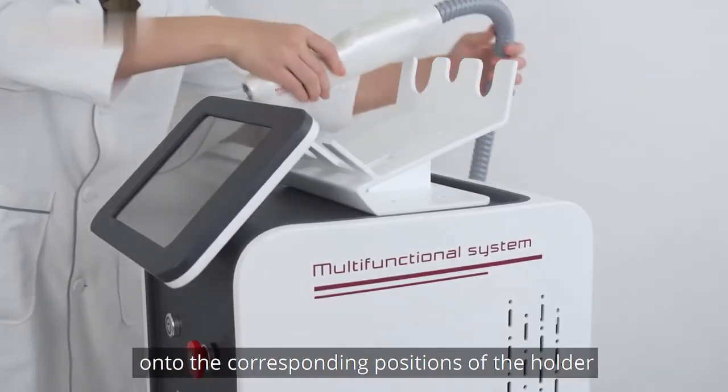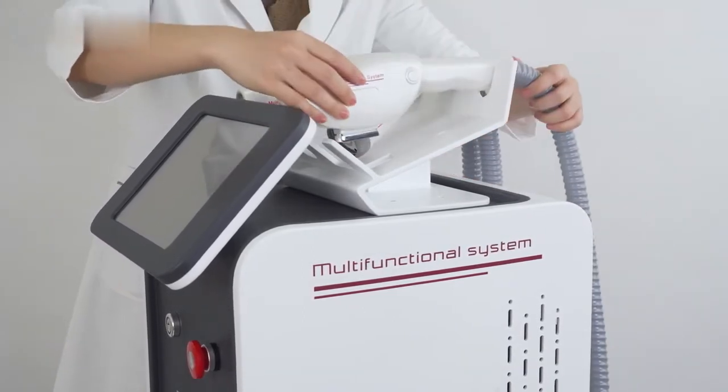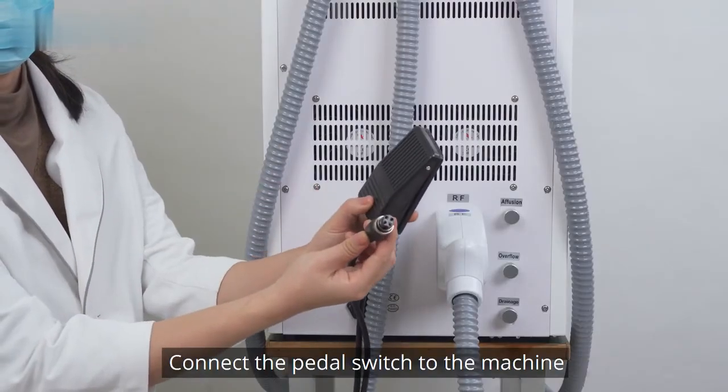Put all the handpieces onto the corresponding positions of the holder. Connect the pedal switch to the machine.